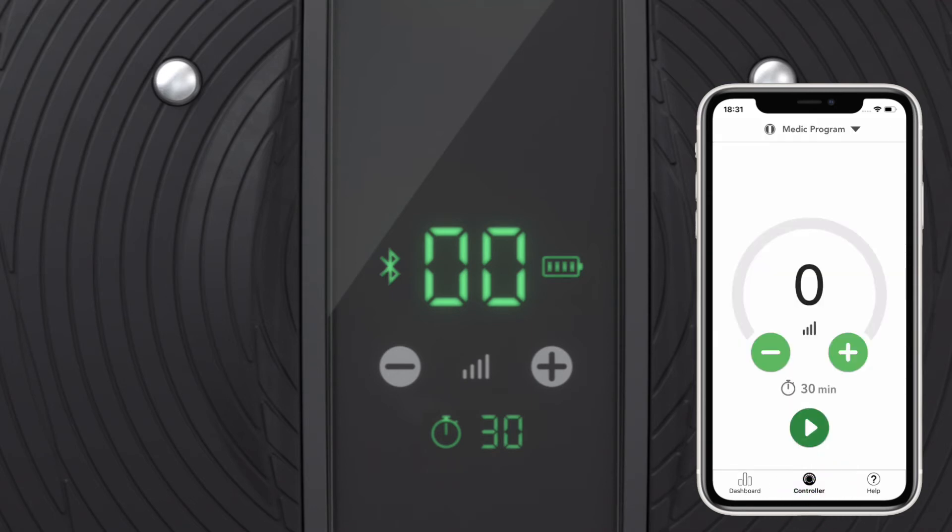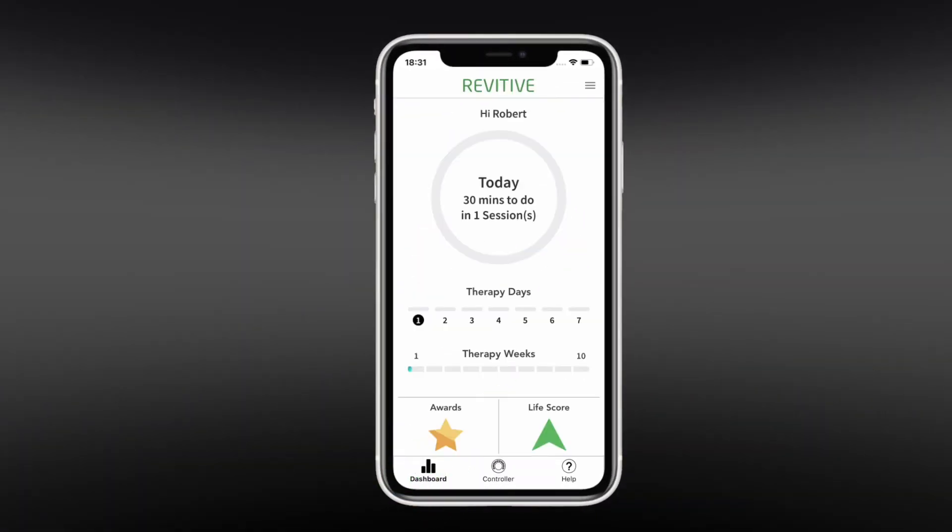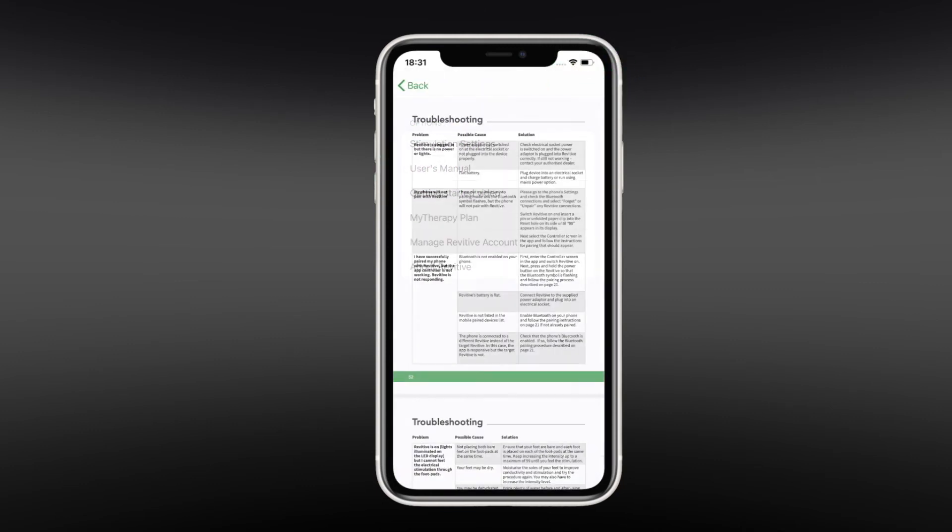If the Bluetooth icon does not display, it means your phone and device are not connected. If you require further assistance, please refer to the troubleshooting section of the user manual.